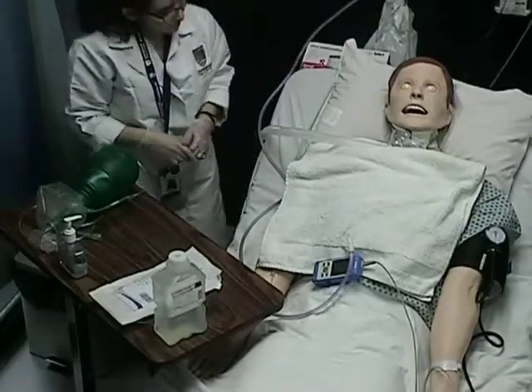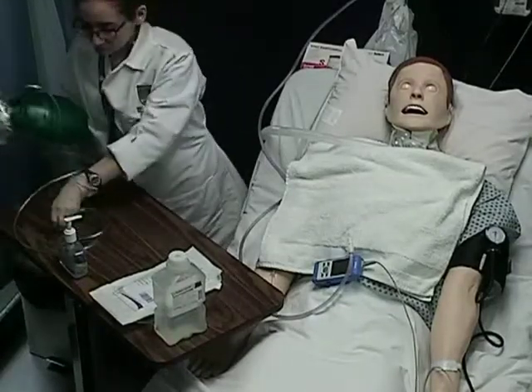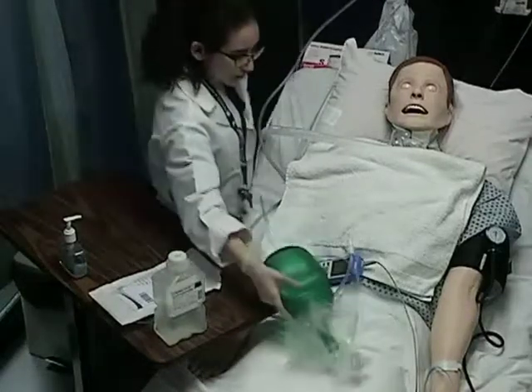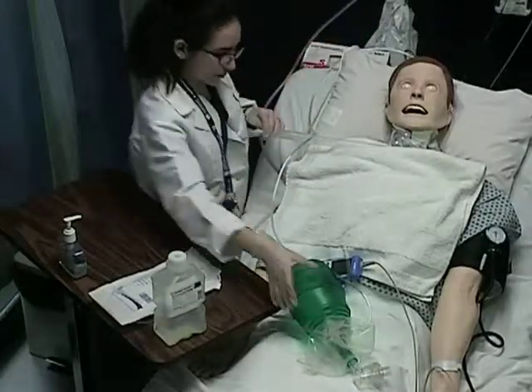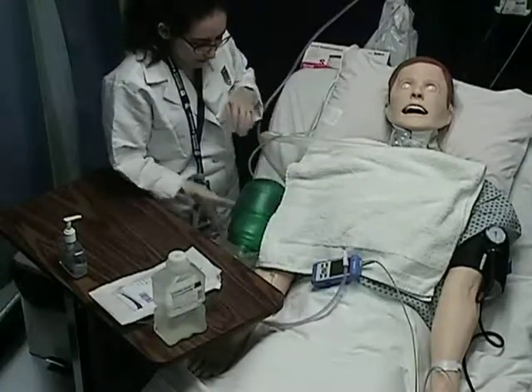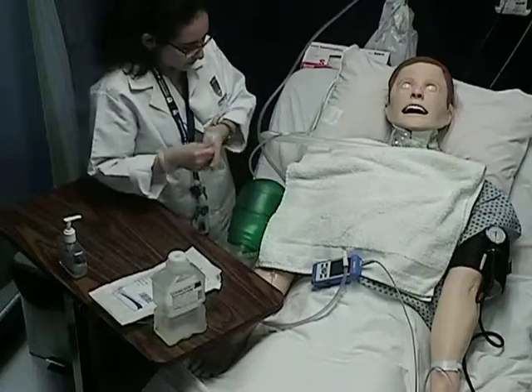You will also connect your patient's ambu bag and place it near the patient. Following this, you will increase the supplemental oxygen supply if indicated. Encourage your patient to breathe deeply. Remove gloves and perform hand hygiene.